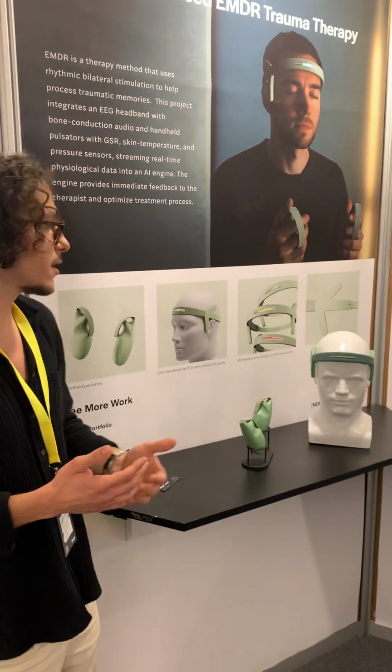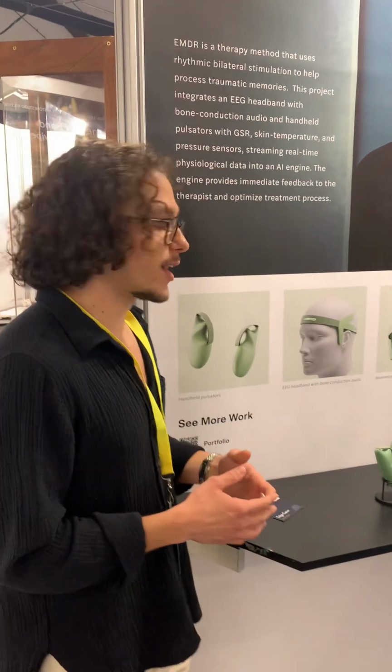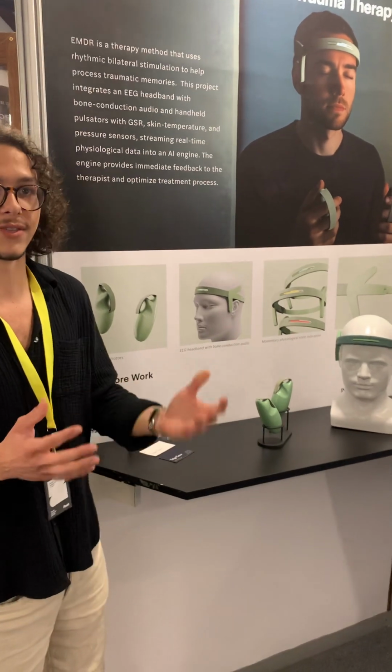So I was thinking, wouldn't it make more sense to include sensors that will gather important physiological data that will allow the doctor to actually analyze the treatment process?